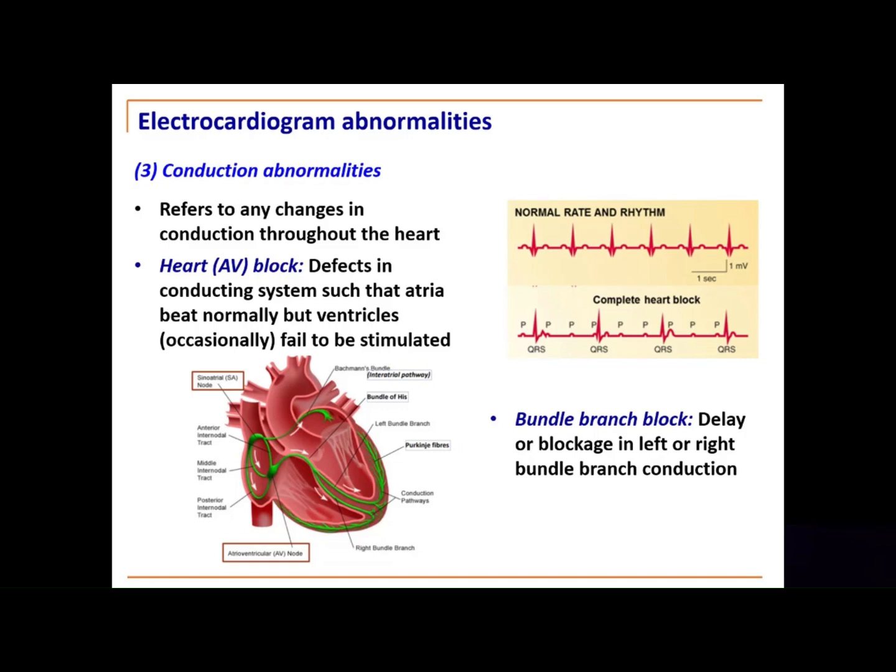When we're thinking about that, what would happen to the width of the QRS complex? Here's the QRS complex, we'll go to the normal QRS complex, and that is about ventricular depolarization. If we're getting a delay, because it's all scarred and fibrotic tissue and the signal's going much slower through the ventricle, then that QRS widens. It becomes longer. It takes longer to get through there.